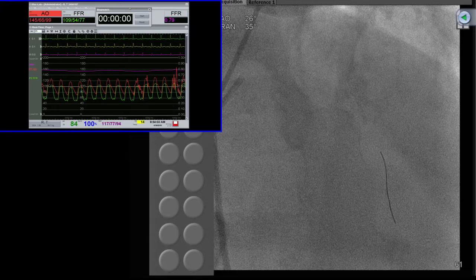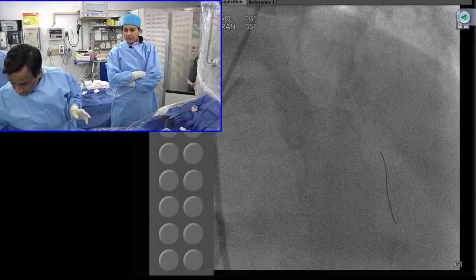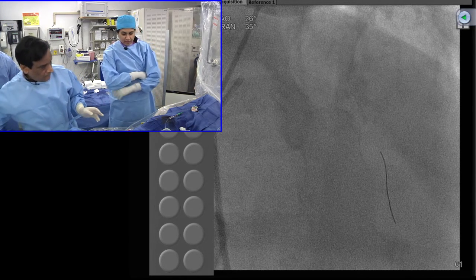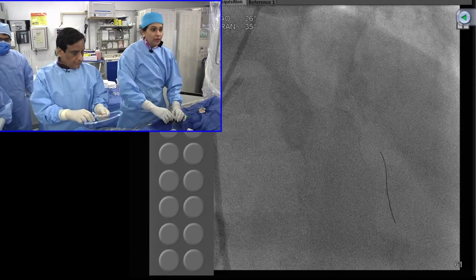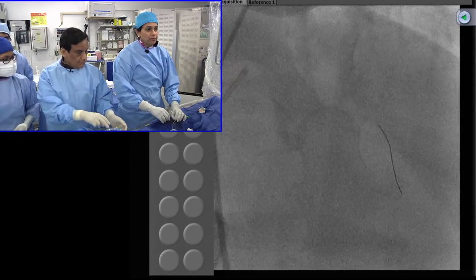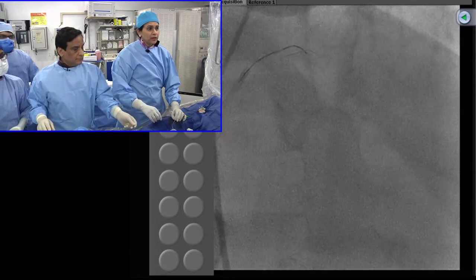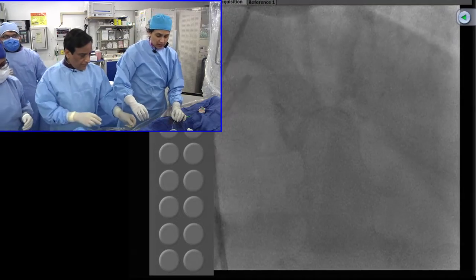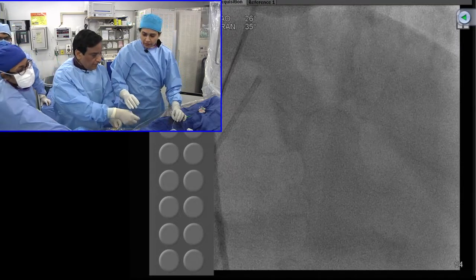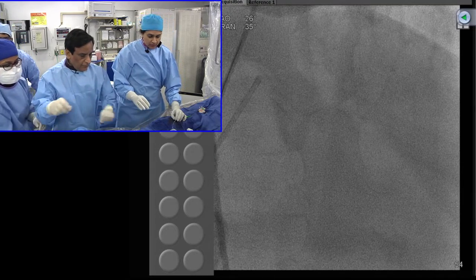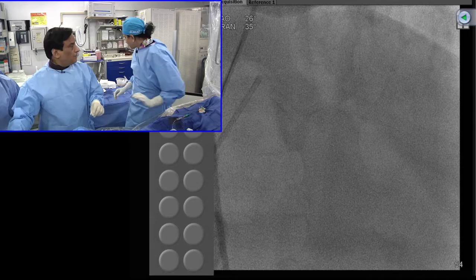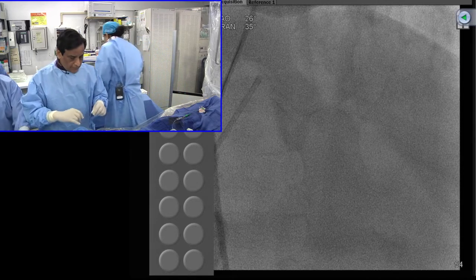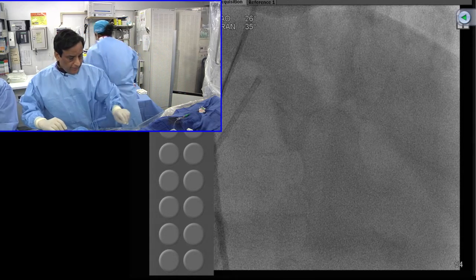Our prediction was correct and we are ready to do the OCT. We will keep this FFR wire and do the OCT. The plan was to do the FFR for the side branch later as well. Now we are going to show the OCT.